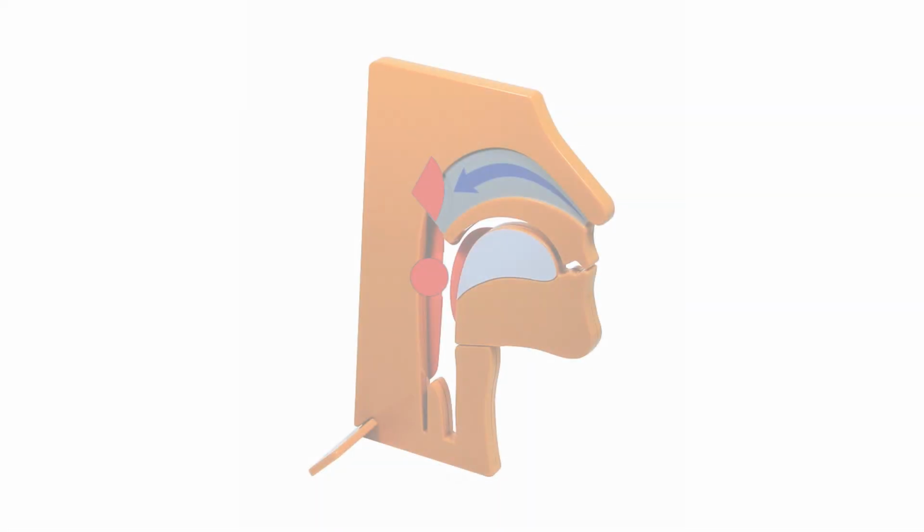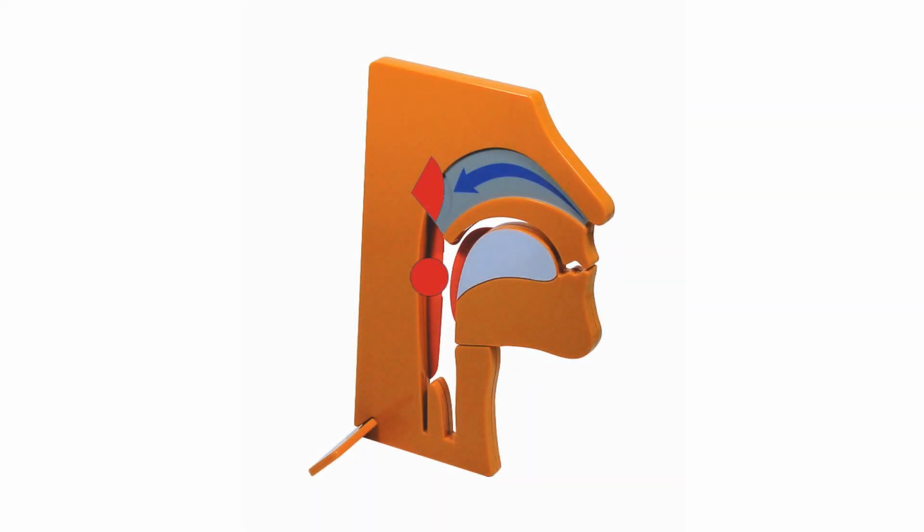So by convincing one more patient in your practice that they are in need of oral appliance therapy, the OSA demonstrator has more than paid for itself.